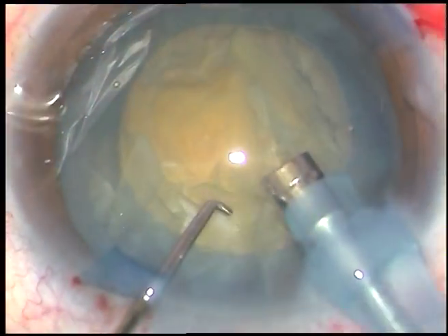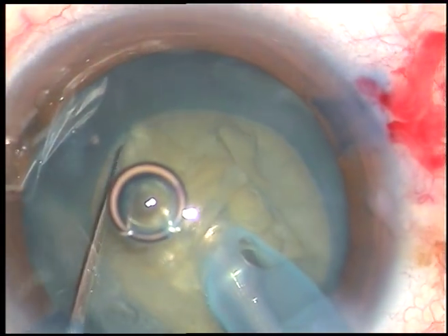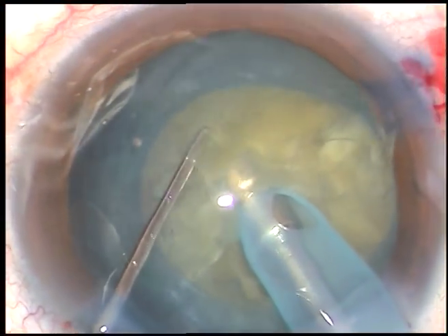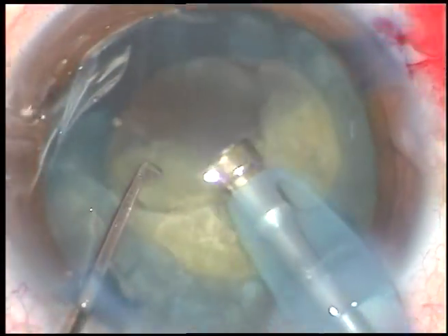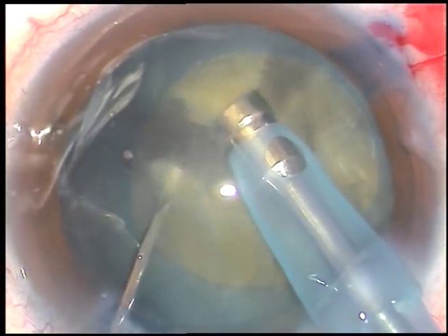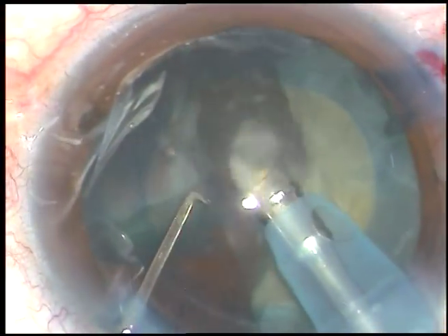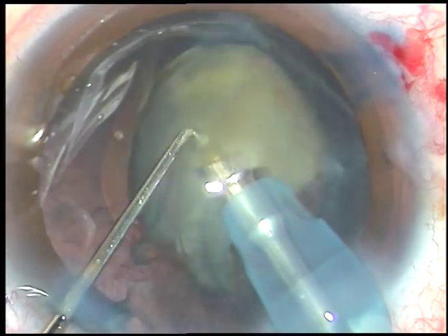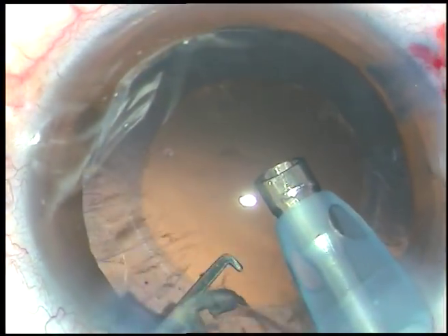After cleaning the superficial cortical matter, the tip is buried and it goes towards the opposite equator for some distance, and the nucleus is chopped. Since the FACO tip moves through the nucleus for some distance, I call it submarine chop. The nucleus is being chopped and each nuclear fragment is emulsified. FACO power used in this case is 65%, flow rate is 45 ml per minute, and vacuum is 450 millimeters of mercury.